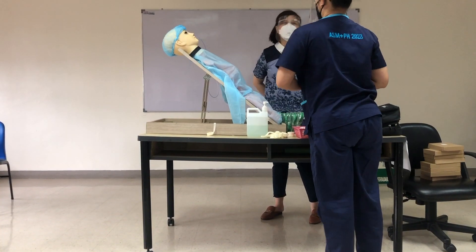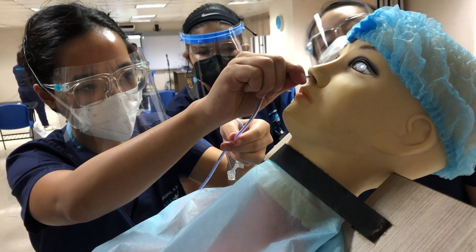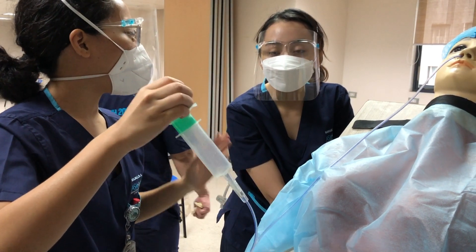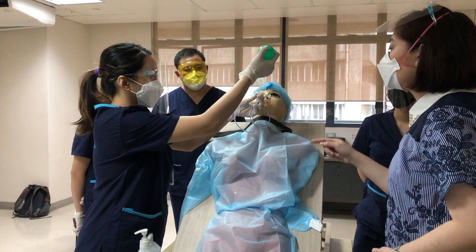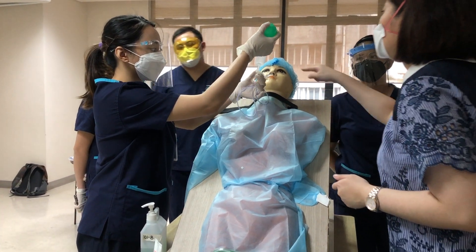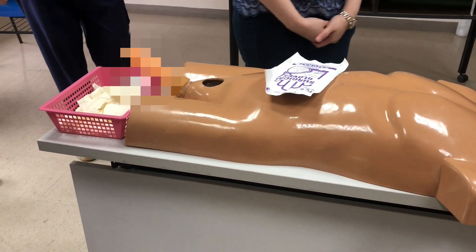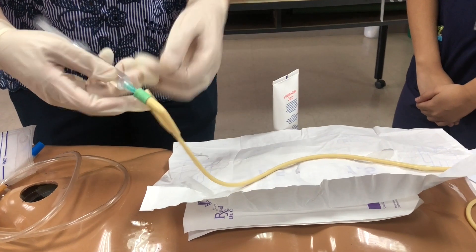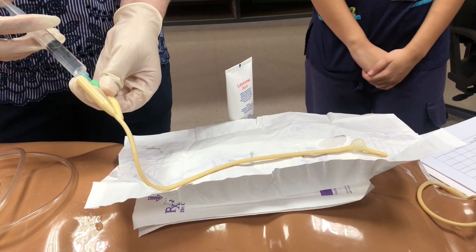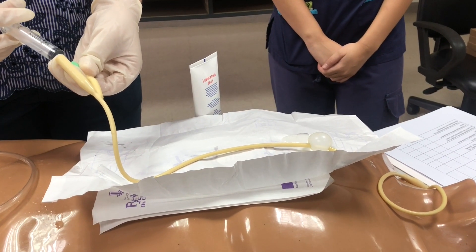In the morning we also practiced inserting a nasogastric tube and Foley catheters into the practice mannequins provided by the school. Here you can see my preceptor demonstrating how the Foley catheter works by injecting a syringe filled with water into it, inflating the balloon at the end. This balloon prevents the Foley catheter from being pulled back out through the urethra, keeping it lodged in the bladder.